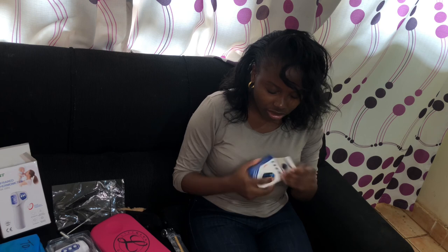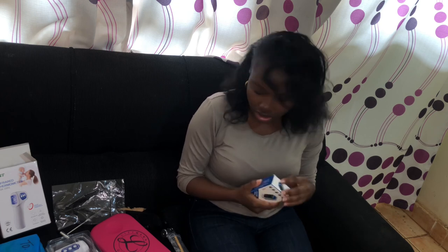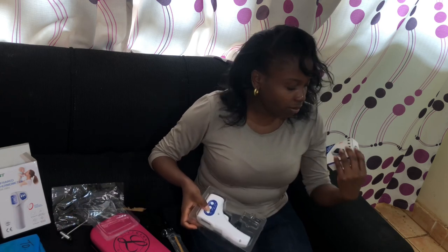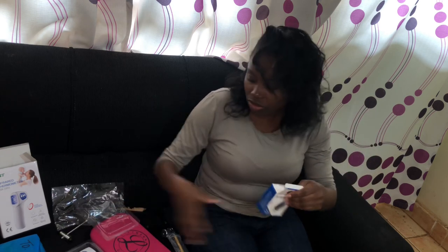The next one is our pulse oximeter. Especially in this time of COVID, of Rona, you need this one. Well, you need this too, your temperature and your pulse oximeter, your oxygen saturation levels. Sometimes you might not have a fever or other symptoms, but the oxygen saturation is low, so this one can help detect that earlier. You understand, guys?